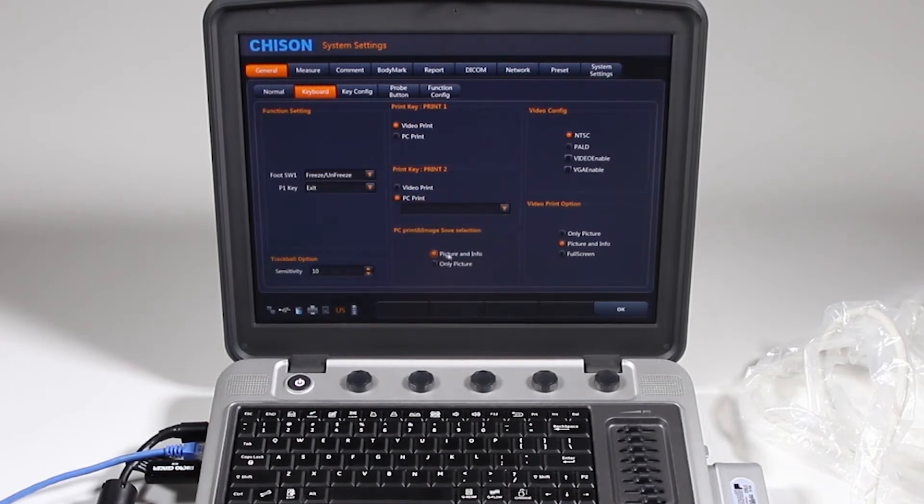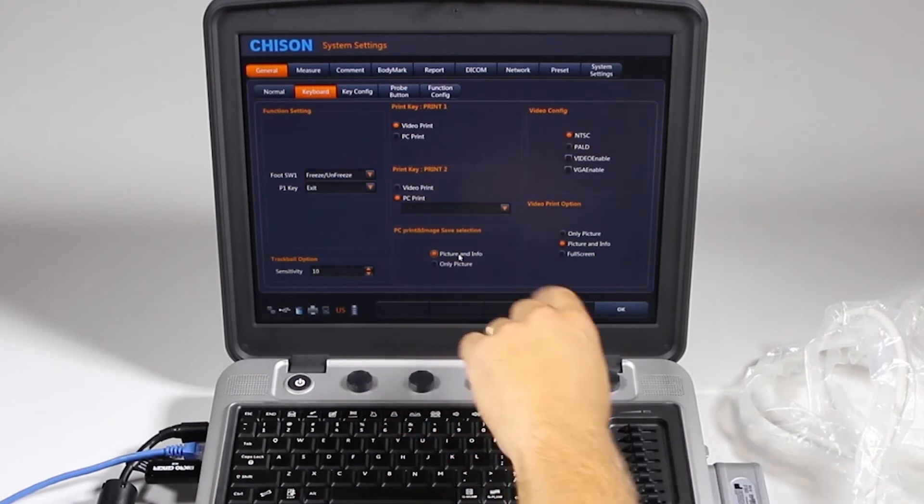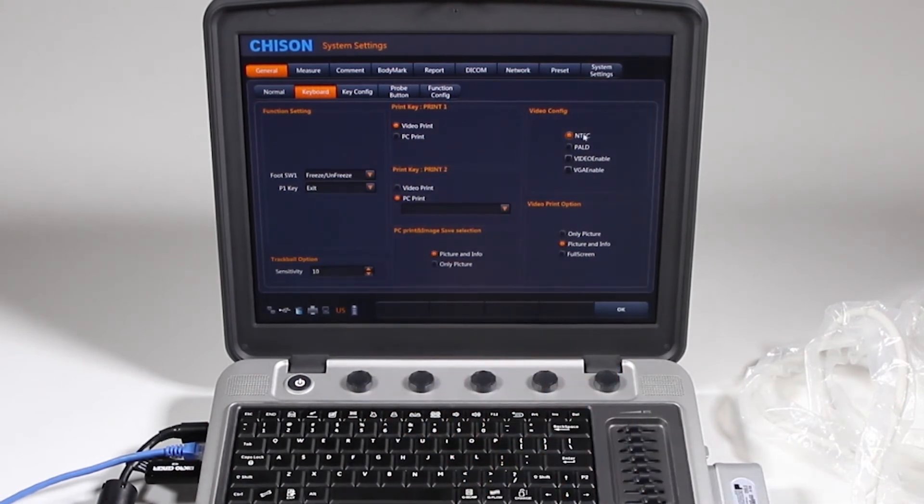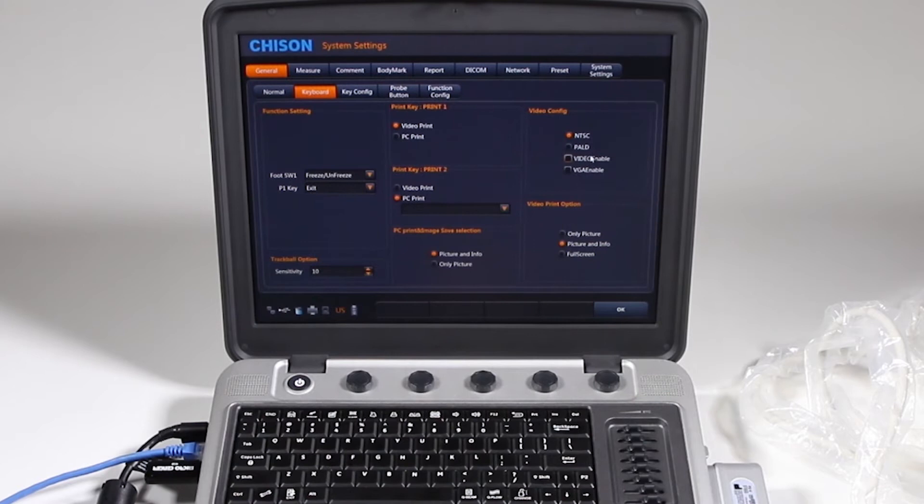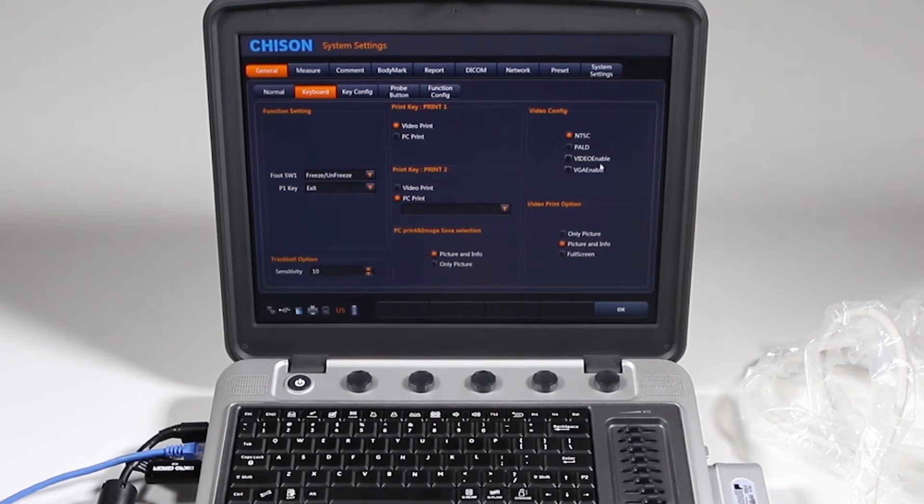When you save, do you want the picture and info along the top, or just the picture? Video configuration, if you're in the United States, leave it on NTSC. This video enable and VGA enable, that is with an external module. If you need external video, this will enable that video for you.